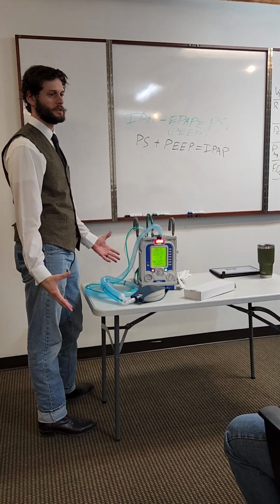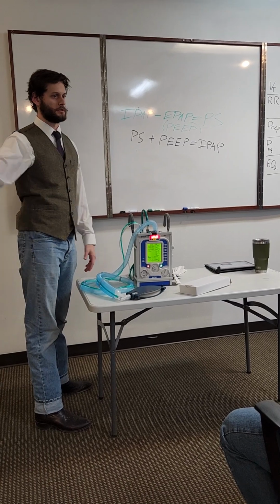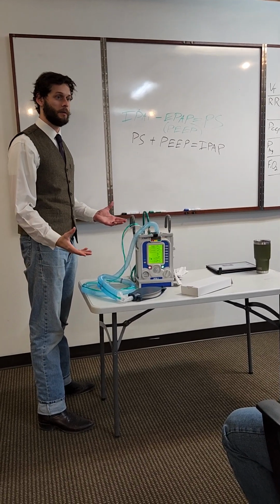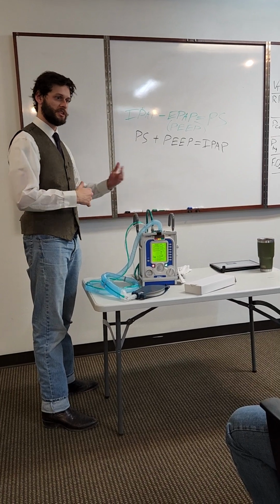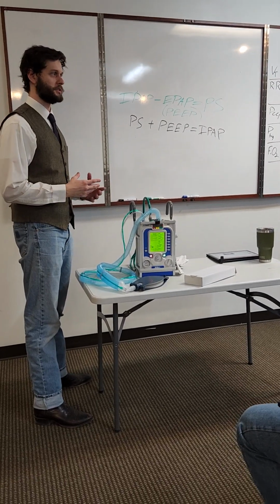purpose, especially for us, because we're not going to be setting up people usually in bi-level in the field. And we're not going to go to St. Joe Villa and be like, yep, this person's a BiPAP candidate, and slap them right on. We might put them on CPAP. We can start them in CPAP, put them on PEEP, but usually you want someone to be on CPAP first before you try putting them on BiPAP. So that's kind of where our differences come.